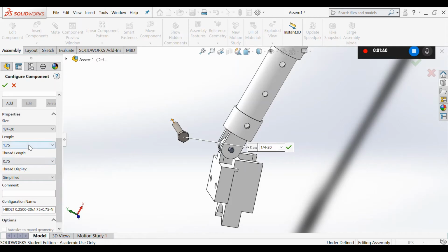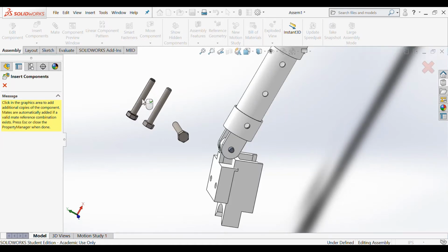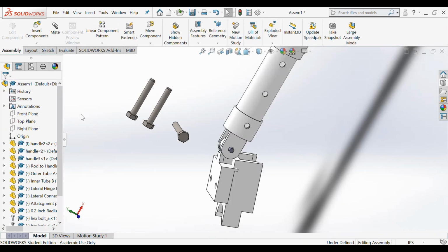I want the length to be 1.75, and I want a thread count of 0.75. So I'm going to go on ahead and click check. And then I'm just going to click 2 more additional times because we're going to need 3 total. And I'm going to push the escape key on my keyboard.